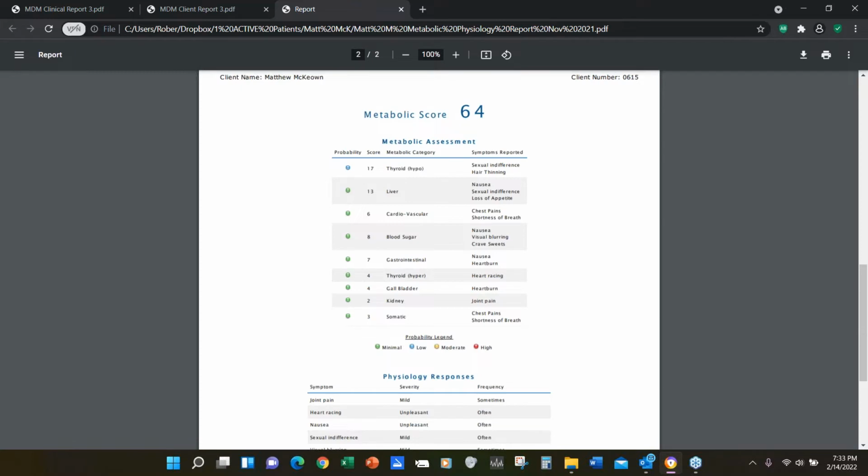And I say, so, you know, the average is about 78, the median's around 50 something, it's in the 50s. And if you're over 150, that's telling me you have physical symptoms which are going to reduce the efficacy of the neurofeedback, and they're going to affect the map. And I just want to ask you, have you been seen for any of these things? And they might say, well, yes or no.